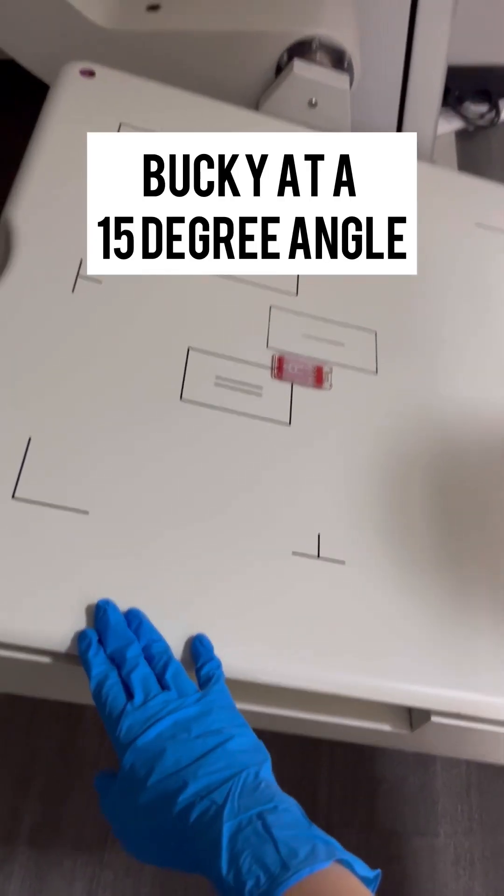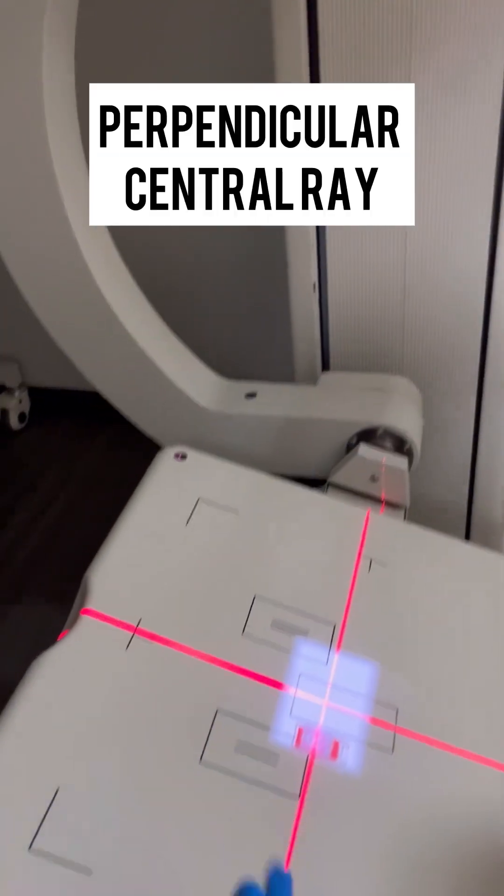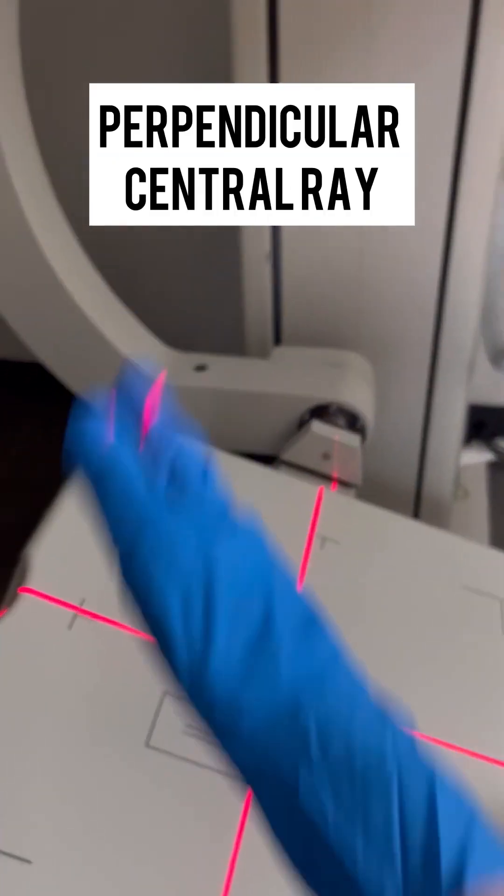The image receptor is at an angle and then we just keep a perpendicular beam, so that makes it easy.